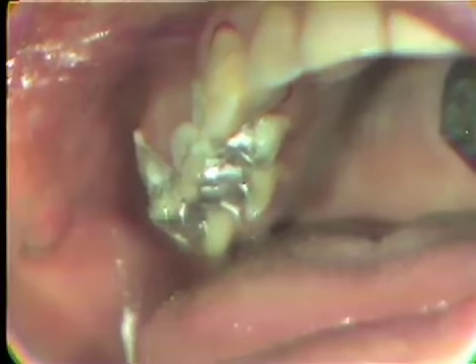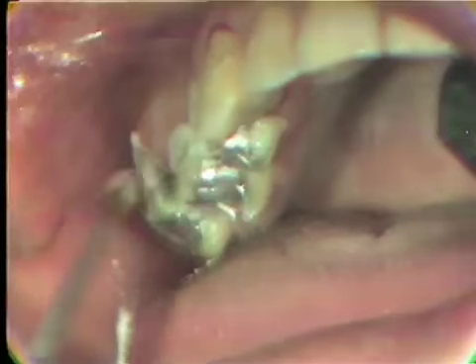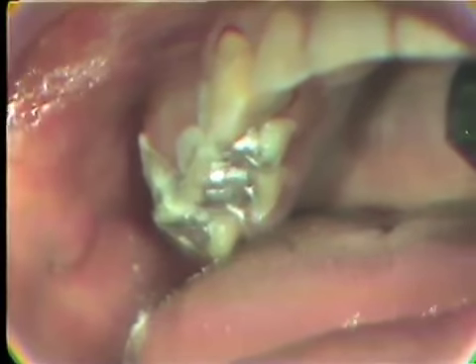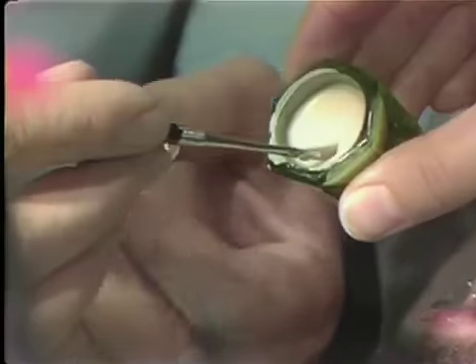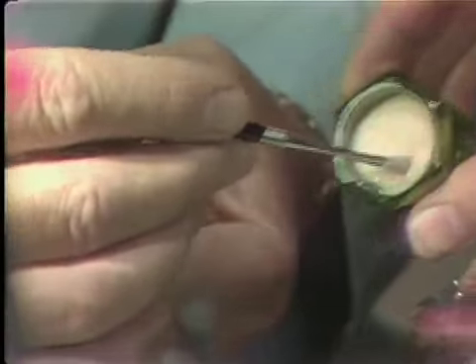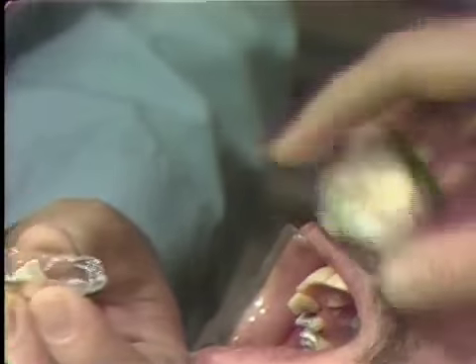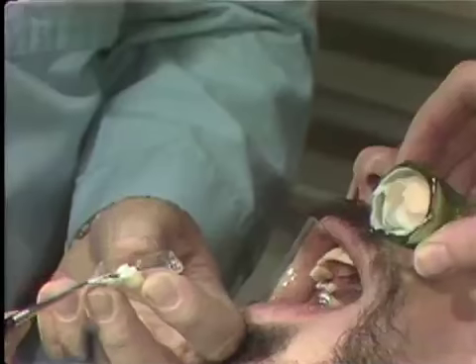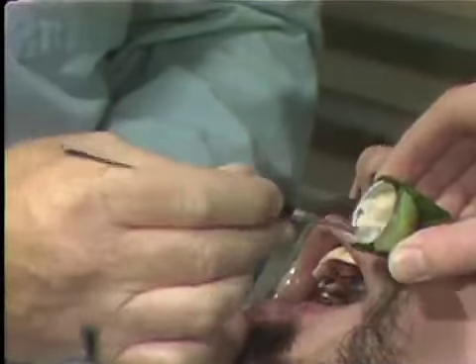The temporaries should be compatible with the gingival tissue. If you cause gingival irritation with the temporary, then this is defeating the purpose. We now load the thin shell that we have with the Duralay material that's in a doughy state.